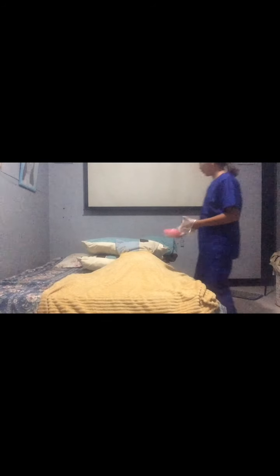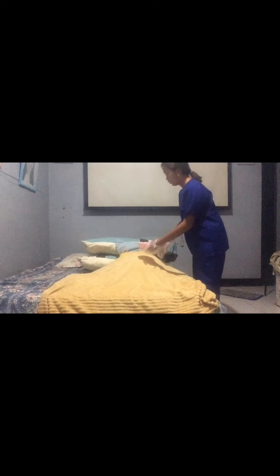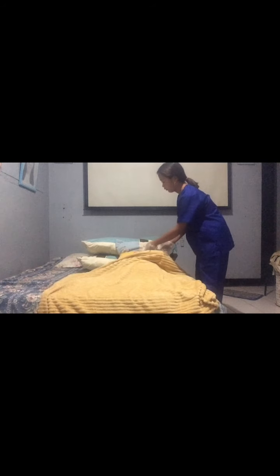Wear gloves. If the client is able to go to the bathroom, give him or her needed instruction. Provide privacy and place the client in mid or high Fowler's position. Place the bedpan. Ask the client to void first, then clean out urine from the bedpan.